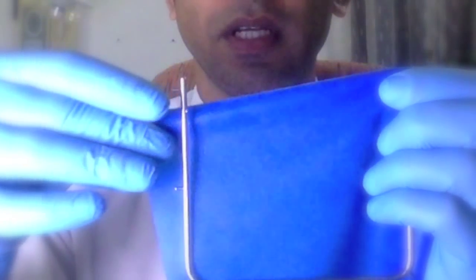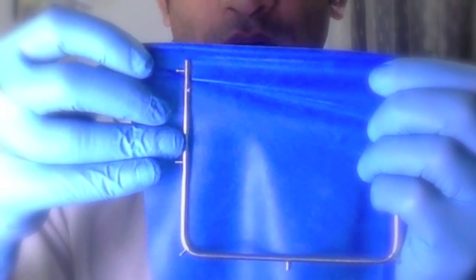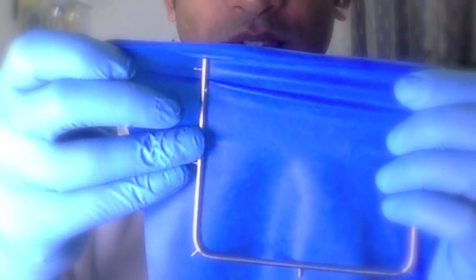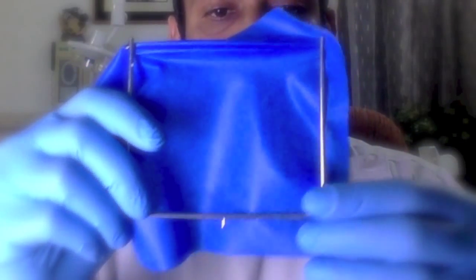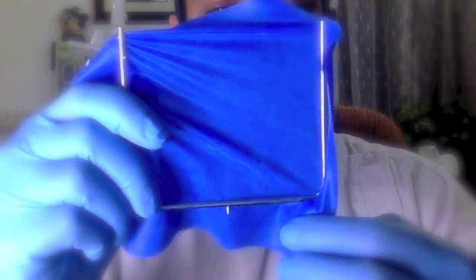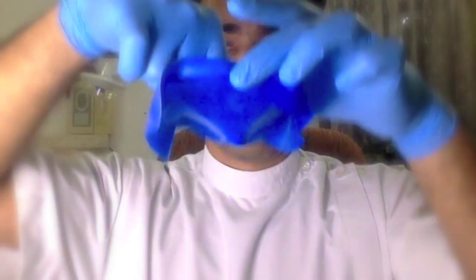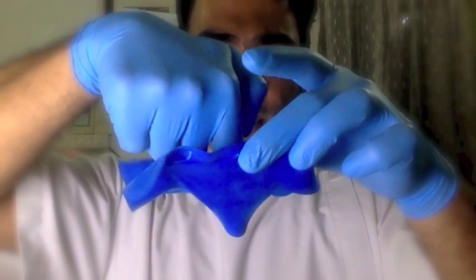I've seen a lot of students wanting to poke this right through the rubber dam — you don't have to do that. Just pull, stretch it across, release and you're done. Now do the same procedure for the bottom two tines. Don't stretch the material too tight at this point. This is so that the rubber dam can actually flex, and what you're looking for is about roughly two inches of flex.